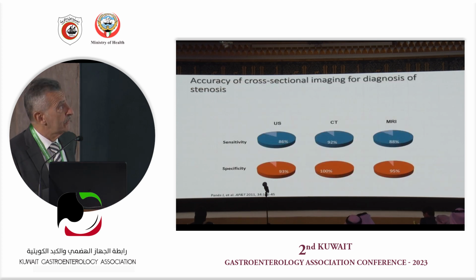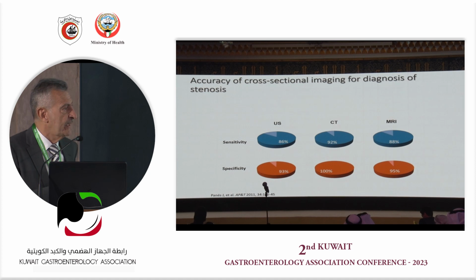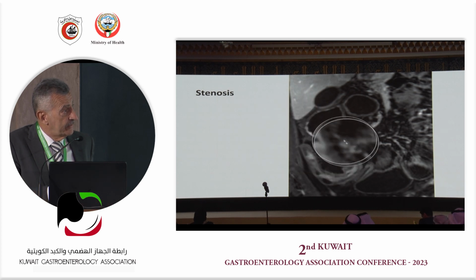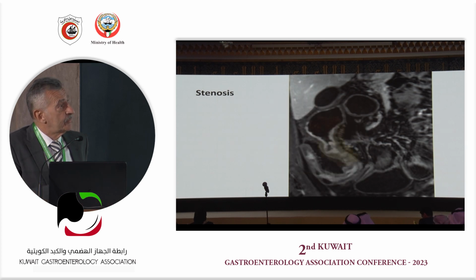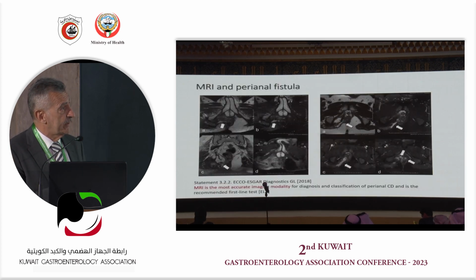Once again, for stenosis, you see there is no clear difference in terms of sensitivity and specificity. This was a review done years ago by Panes among the three methodologies. And once again, you see here the very nice picture of stenosis, and if you look, the anatomical picture there is quite amazing.